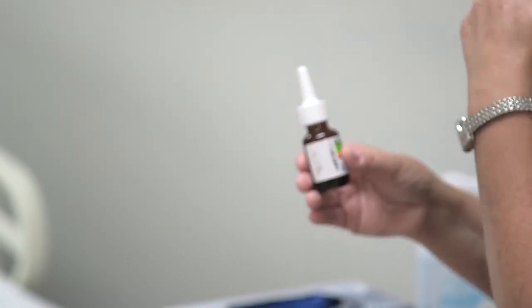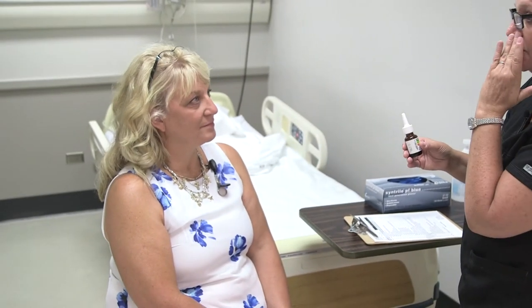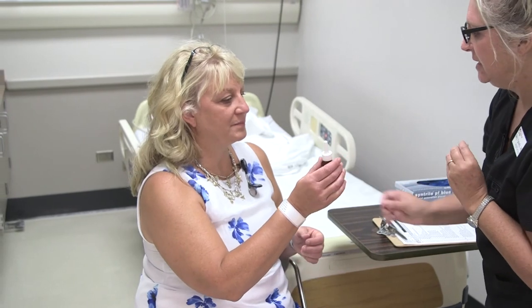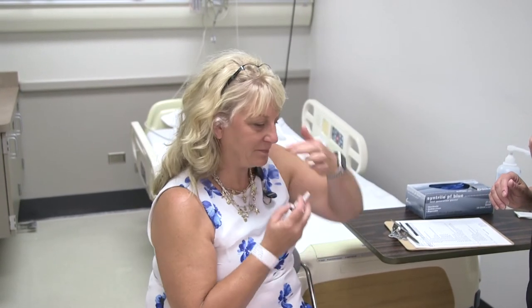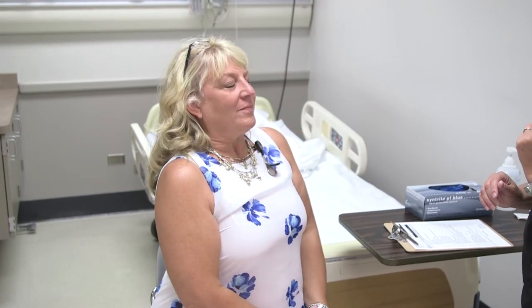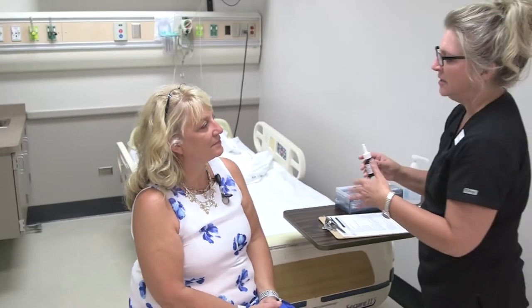When administering this, you should take a couple of breaths through your nose first. When you're ready, close the nostril you are not using. Okay, take a deep breath and breathe in — hold, hold — good. Now we'll do the other one. Good, very good. If I were administering this to Sylvia I would assist her with that as well.